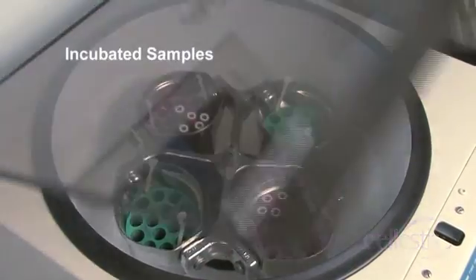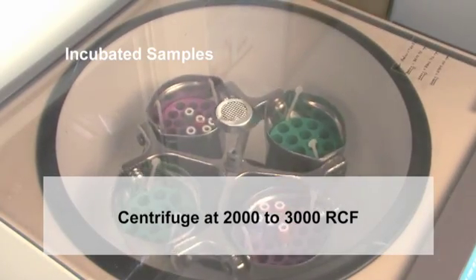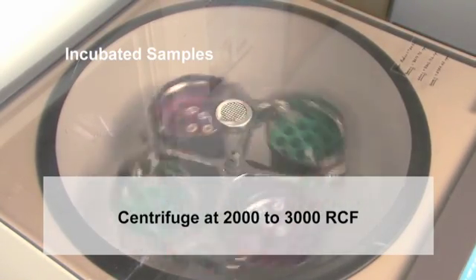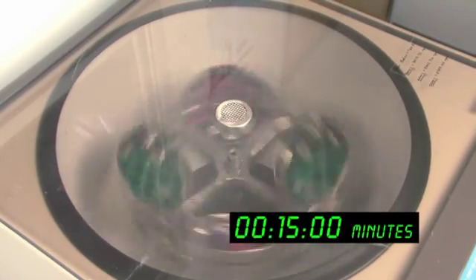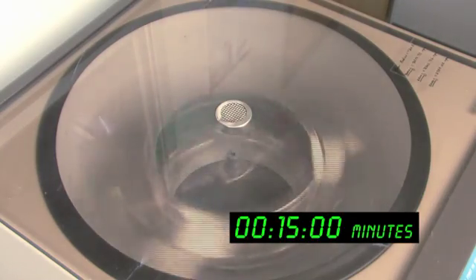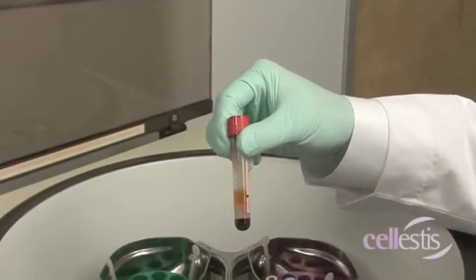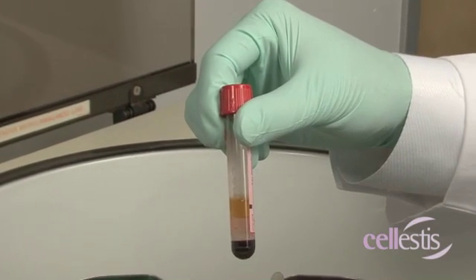Plasma separation involves centrifuging the tubes at 2,000 to 3,000 RCF for 15 minutes. The gel plug will separate the plasma from the cells, enabling easy removal of plasma.